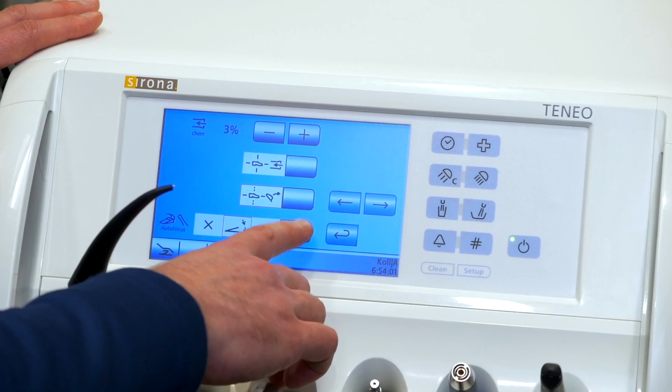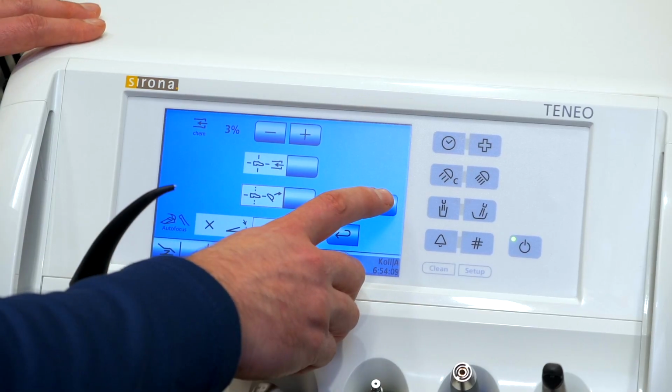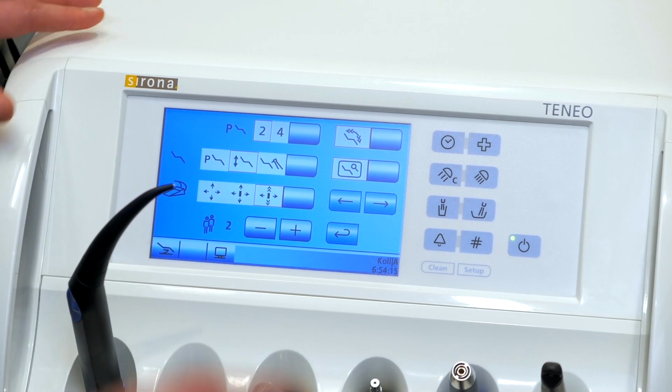This will allow me to half hold on the foot pedal to focus and fully press that to freeze the image. If I take it on the last setting here, that will focus and freeze the image all in one press. Advancing one more screen takes us to the end and we're back to our main list of settings here.